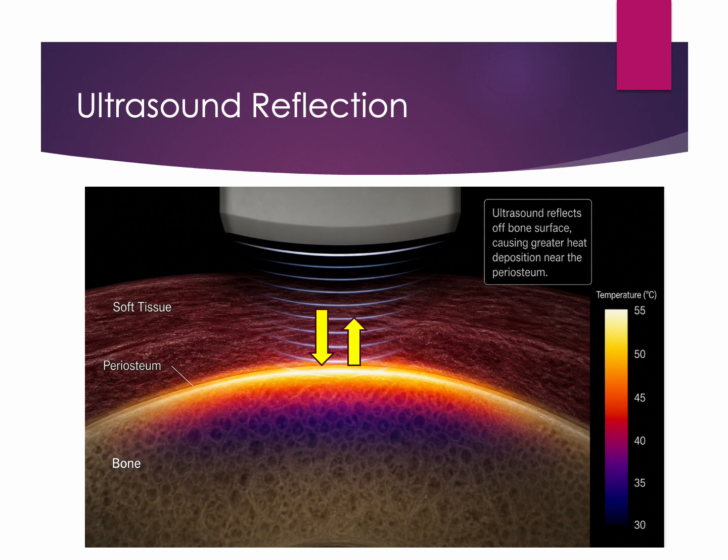Clinically, this is why patients sometimes report a sharp, achy sensation near bone during ultrasound, what we often refer to as periosteal discomfort. In this picture, you can see how the area close to the bone receives double the amount of energy, first as it comes from the ultrasound wand, and second as the energy reflects off the bone back through the same tissue. This is why technique is so important when applying ultrasound. Keeping the sound head moving helps prevent hot spots from reflected energy, and selecting the correct parameters ensures that enough energy reaches the target tissue to produce the desired effect.